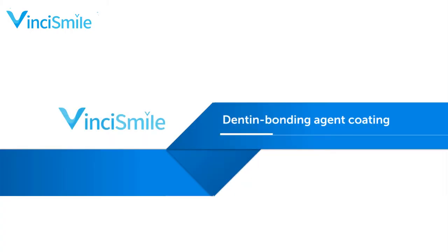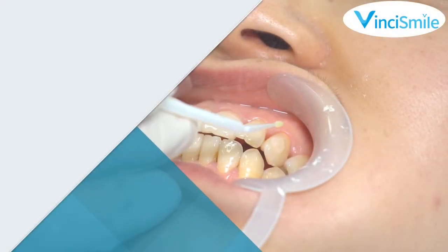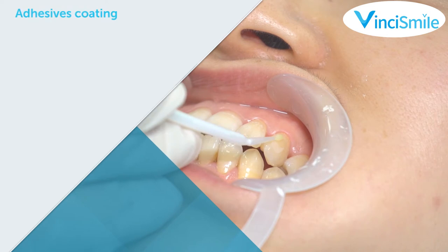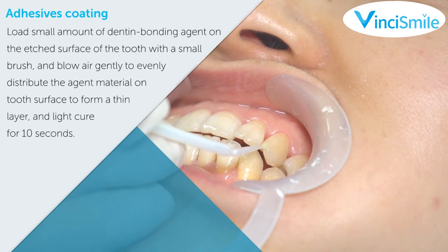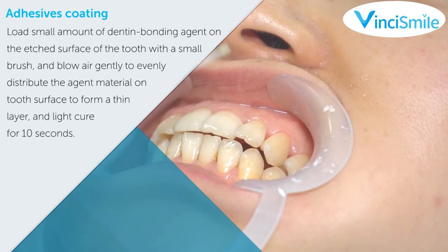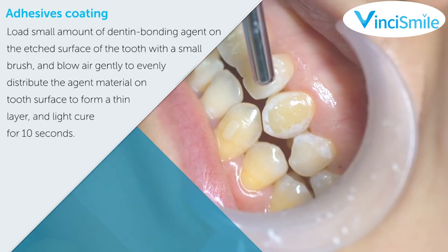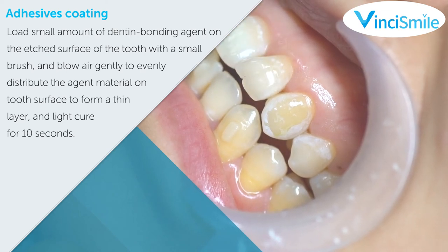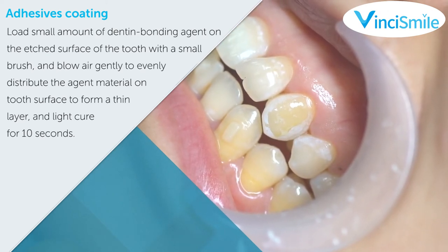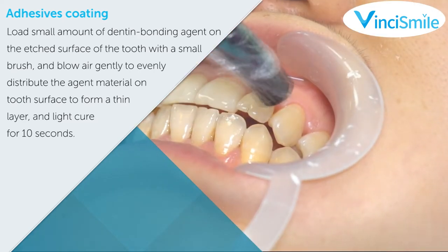Dentin bonding agent coating: apply a small amount of dentin bonding agent on the etched surface of the tooth with a small brush, and blow air gently to evenly distribute the bonding material onto the surface to form a thin layer, then light cure for 10 seconds.